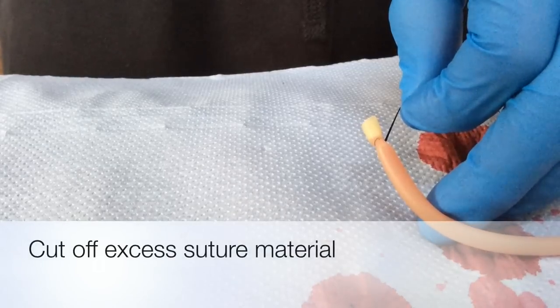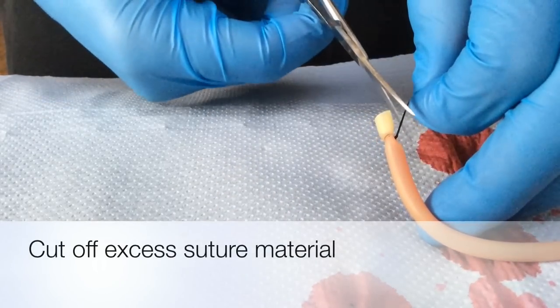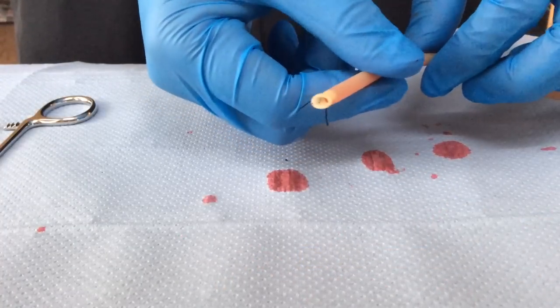To finish, cut off excess suture material. This is a ligated blood vessel.